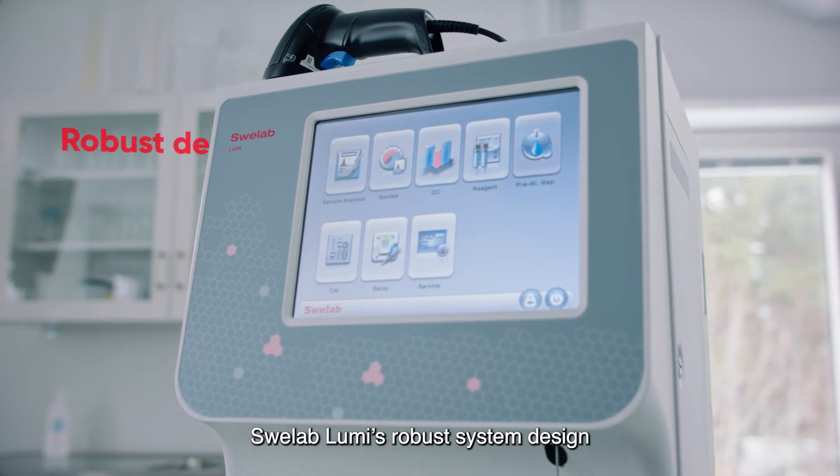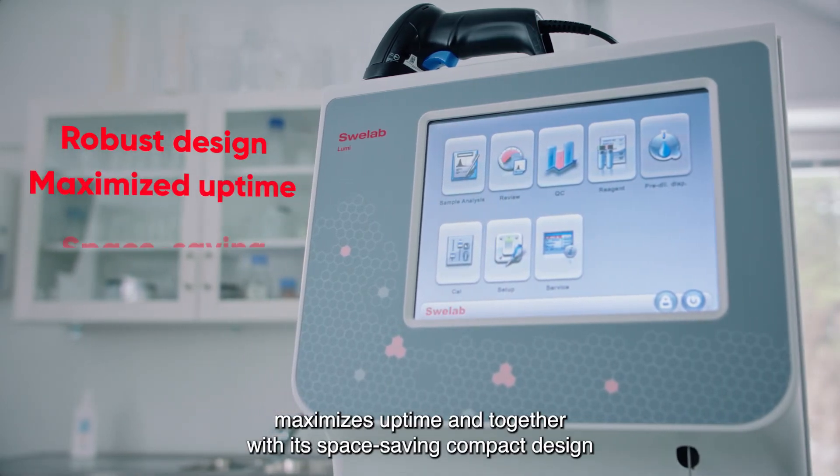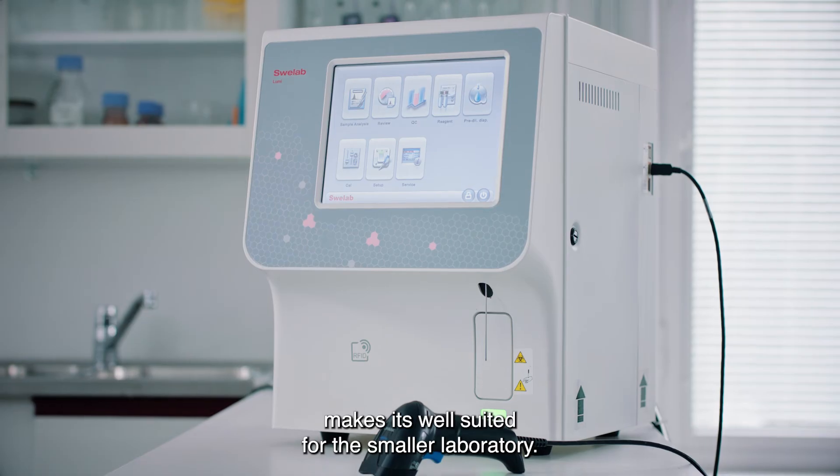SWE Lab Lumi's robust system design maximizes uptime and, together with its space-saving compact design, makes it well-suited for the smaller laboratory.